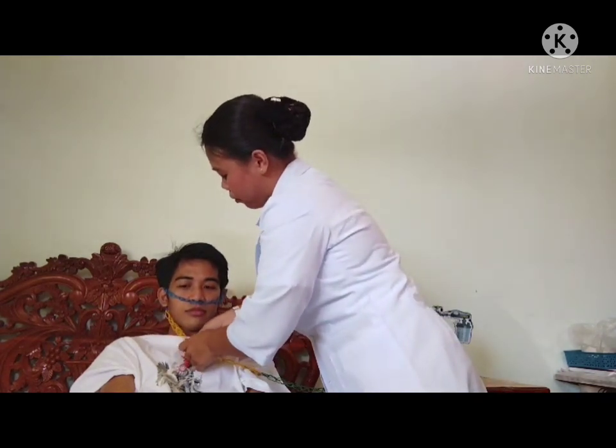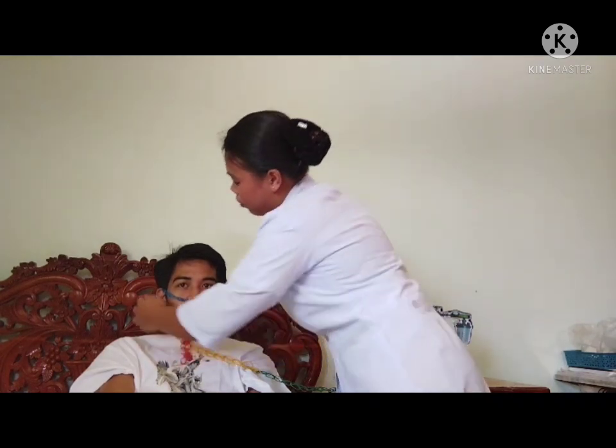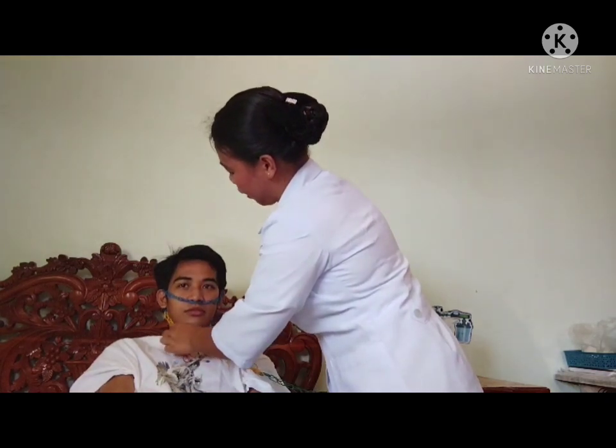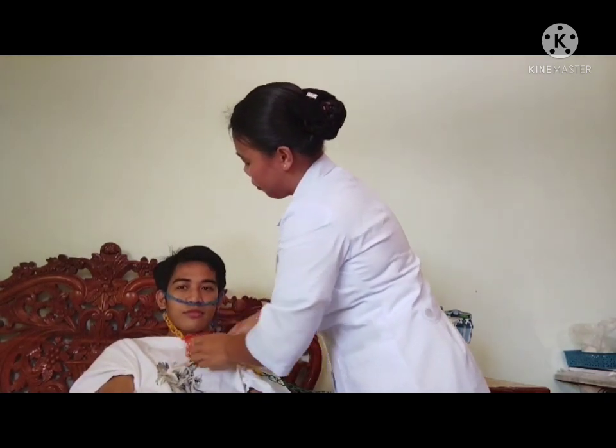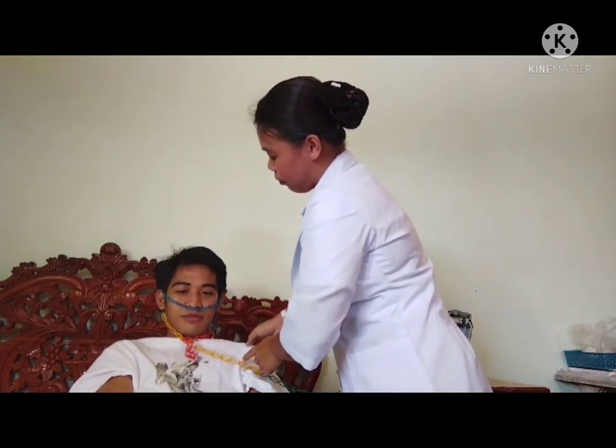Place gauze pads at ear beneath the tubing as necessary. Adjust the fit of the cannula as necessary. Tubing should be snug but not tight against the skin. Encourage the patient to breathe through the nose with the mouth closed.